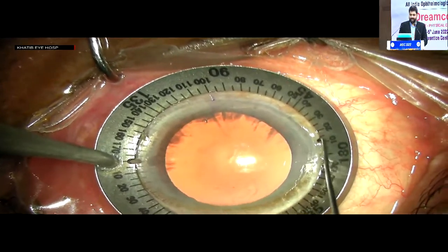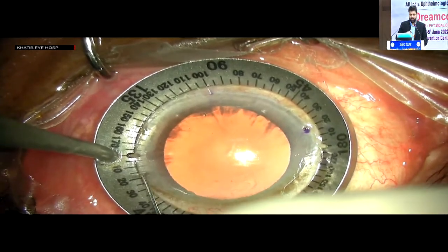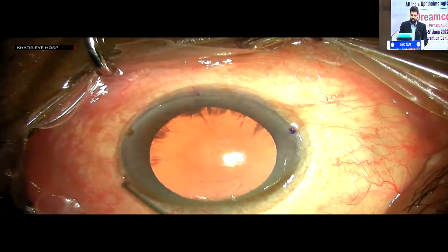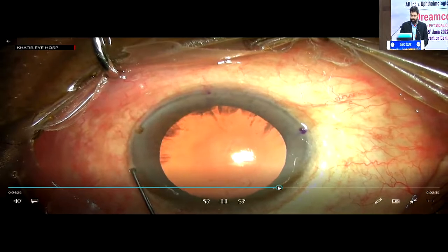So I don't use the fancy equipment, I just use a Sinsky which has a mark, because I want point marks. I don't want the line marks because they can also lead to parallax errors. So I mark it at 20 degrees. This is pretty straightforward. Once you do this well, I've got my 20-degree marks, and you can just continue your phaco routinely.